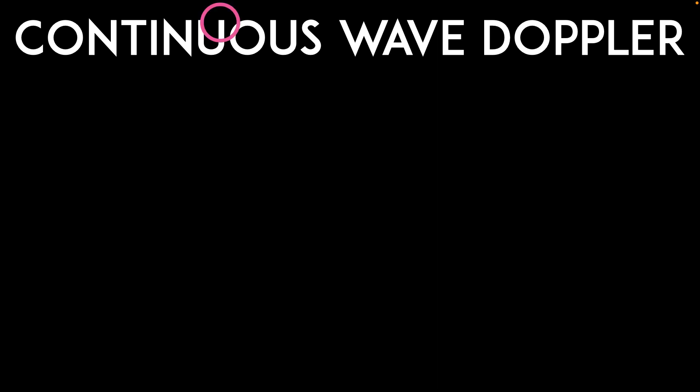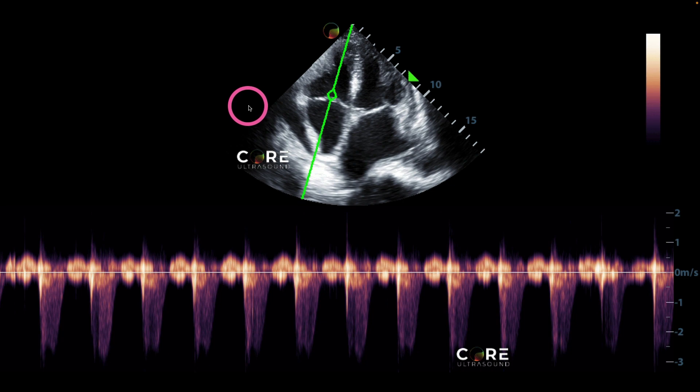Moving on to continuous wave Doppler, which is quite similar. The difference, besides the diamond-shaped marker on screen, is that it measures velocities across the entire line, not just what's inside a gate. Here we're looking at the right side of the heart — the right atrium, the tricuspid valve, and the right ventricle. We're seeing flow going away from the transducer through the tricuspid valve, which it shouldn't be doing; blood should only be moving towards the transducer. This is tricuspid regurgitation, identified with continuous wave Doppler. We can also see it with pulsed wave Doppler, but for higher-velocity jets, continuous wave Doppler is the better choice.